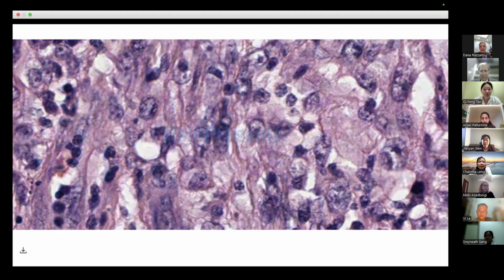Yes, so PRAME, in general, we're using it for melanocytic lesions. But if it was 100%, they didn't need the dermatopathologist anymore. So it has several clones. A couple of the clones, one of them is better than the other one. So there are some rules. It's not about just positive or negative. It's 1+, 2+, 3+. It's about the percentage of how many of the cells are positive.